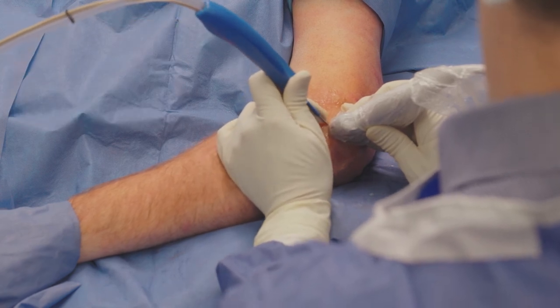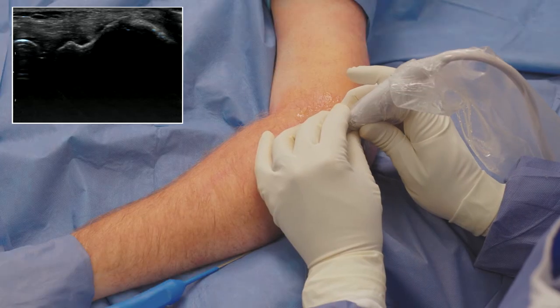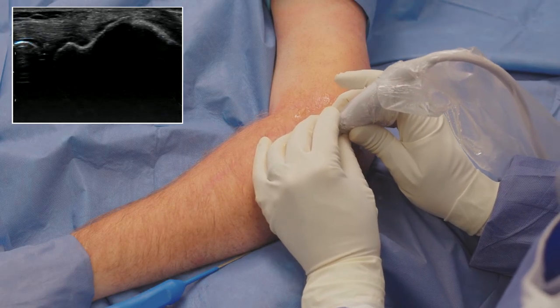After three to five minutes of debridement with TenJet, I scan the tendon again to confirm that I have reached all of the diseased pain-inducing tissue.